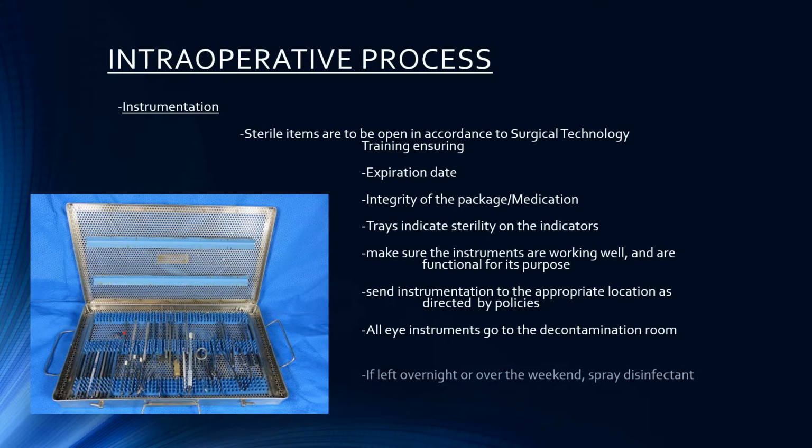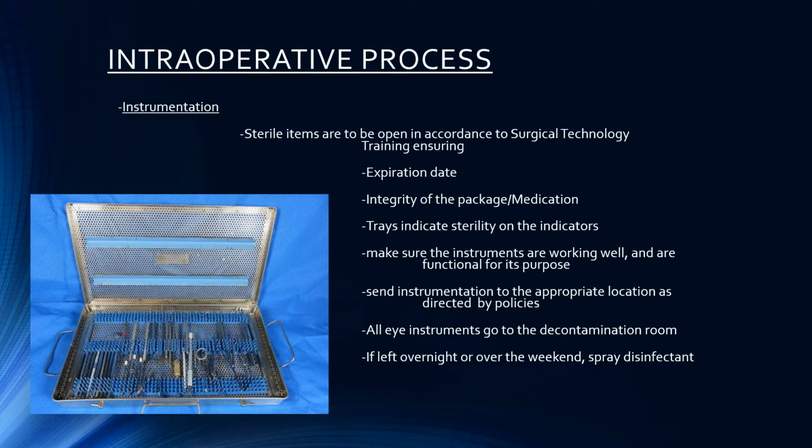And sometimes you're done with your cases, you're not the decontamination guy, you're actually the guy that just brings them over to decontam, so you put them in the room. But if you're going to leave them there overnight, where they're going to be taken care of, just spray that disinfectant on it, so that they don't have that dry blood until the next day. You want to make sure that it's nice and disinfected from the night before. That way when the first person in the morning comes to get the instruments to reprocess them, it's not all gunky and dry, like I was saying.